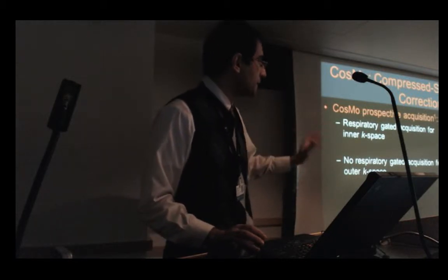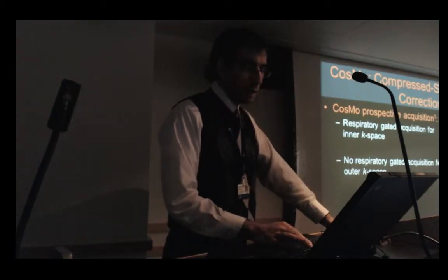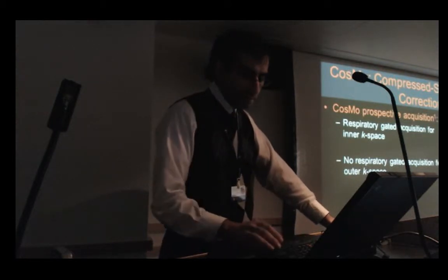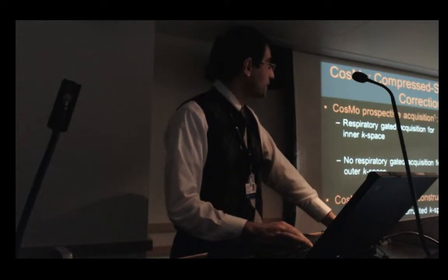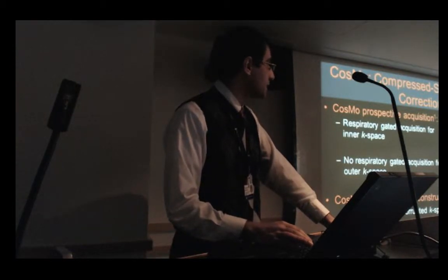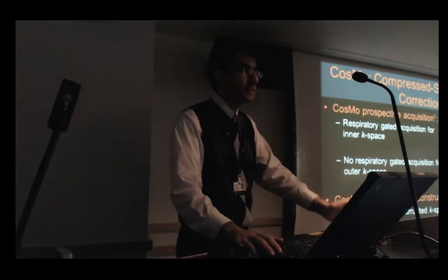So to go to the detail of that, we look at the center of K-space lines. As you can see, it contains the highest energy of the data. So we use the respiratory gating, the navigator, to acquire these K-space lines within five to 10 heartbeats, which is going to be around, I would say, 10 to 20 seconds, for example, assuming the heart rate is 60 beats per minute. And then we don't do any respiratory gating. Basically, that narrow gating window doesn't exist anymore. We accept all the data to save imaging time.